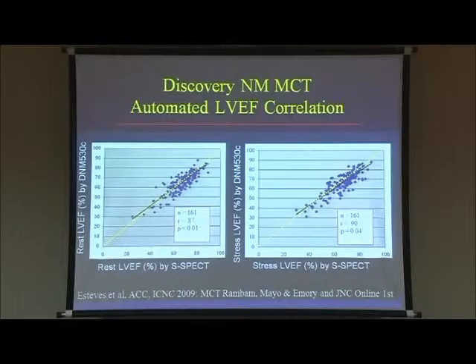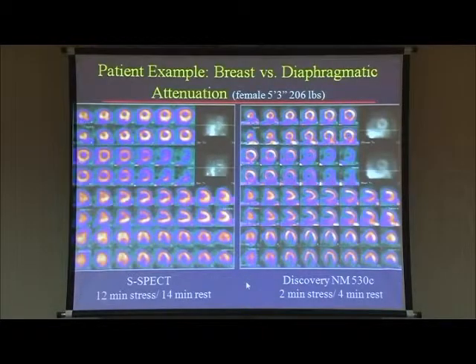And similarly, somehow I don't have the slide with the actual publication, but you can find it and see that also the volumes and the ejection fraction agreed quite well, comparing the 2 different systems in these multi-center trials from the 3 different institutions.